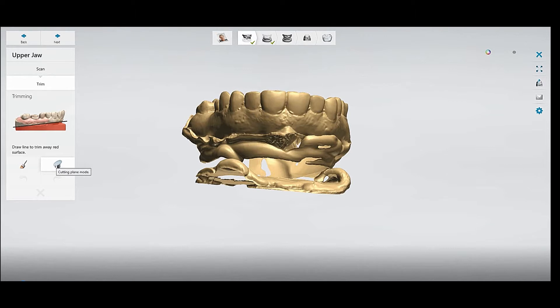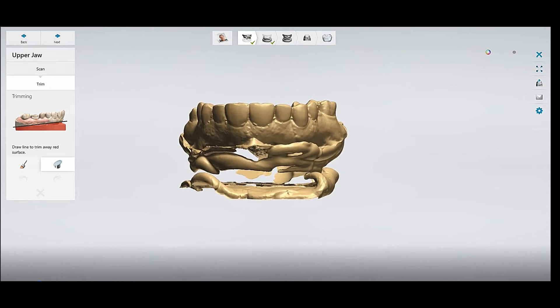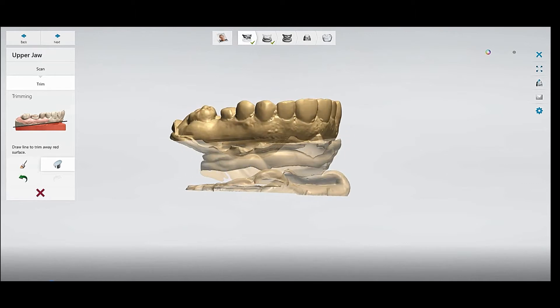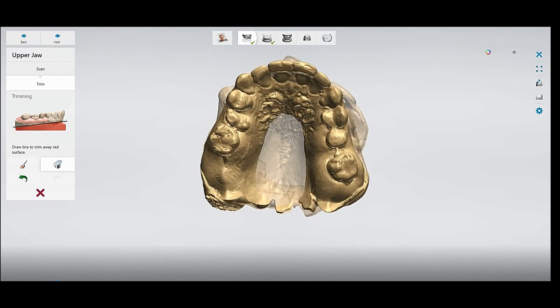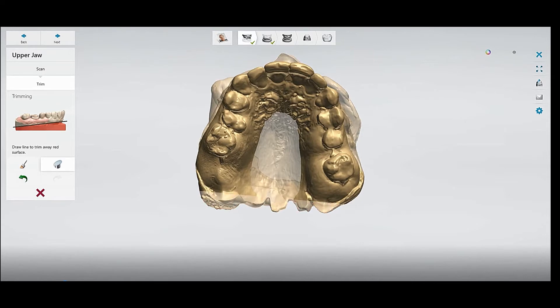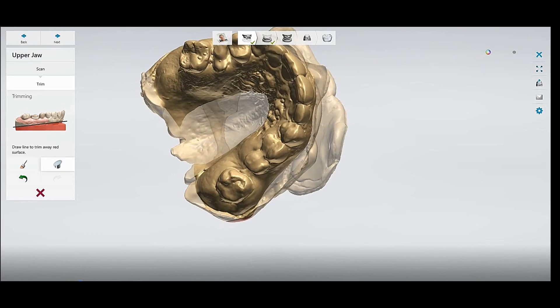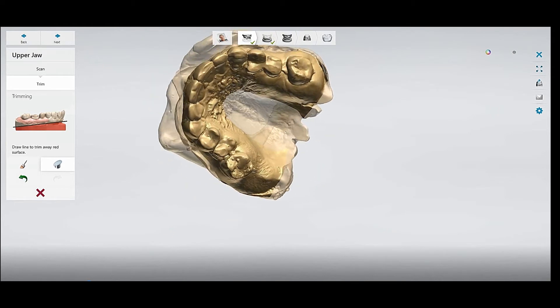You can use both ways to trim the scan — you can keep the area you want and the other area you can cut. For using the cutting plane method, you can just draw a straight line and that's all. You can also trim the small areas around the model that you don't want, to make it look nice. This is the easy way using the cutting plane method to trim the scan.